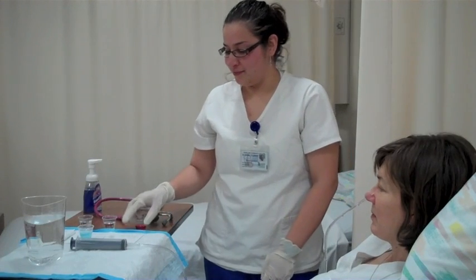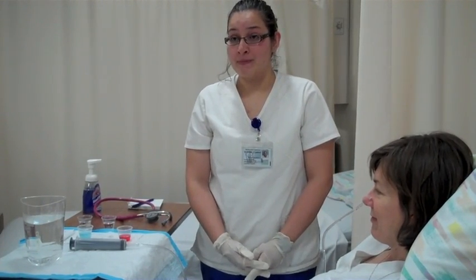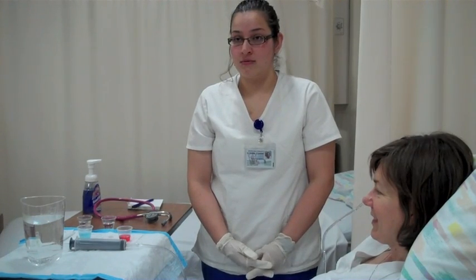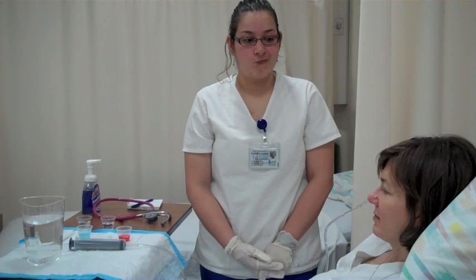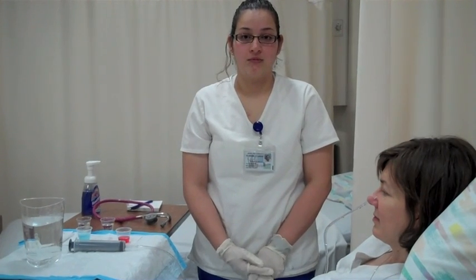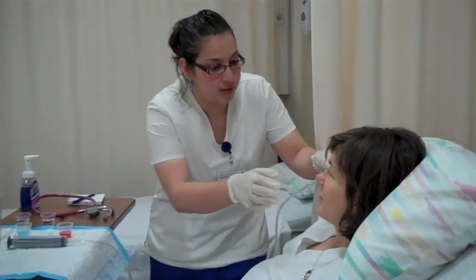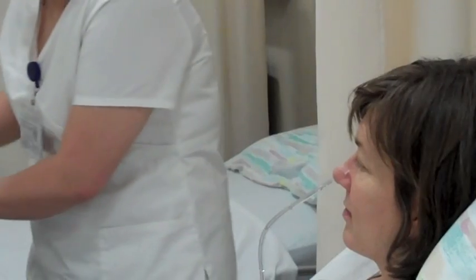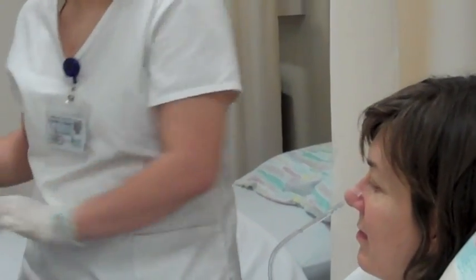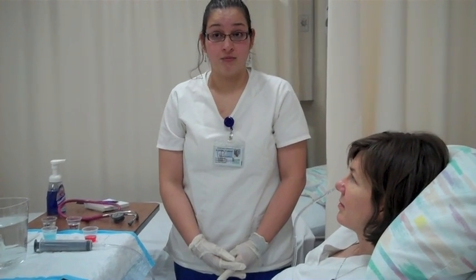Okay, thanks. Step 5. The next step to administering medications is to check for tube placement. Placement is verified most accurately by using multiple methods. One method is to check the mark made on the tubing. Okay, I'm going to check the mark that is on your tubing here. When NG tubes are inserted, a mark is made by the nostril once placement is confirmed by X-ray. This provides a way to see if the tube has moved.